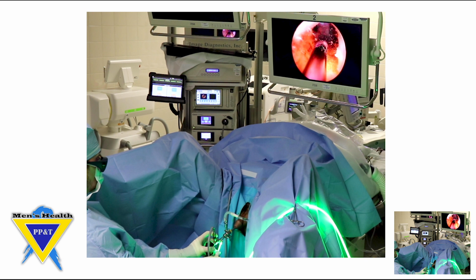As you can see in the top right-hand corner of the screen, there is a monitor which projects the picture from the cystoscope that I can view and watch while I'm performing the procedure on the inside of the bladder and prostate channel. In the bottom left and middle portion of the screen, you can see myself, the surgeon, directing the laser through the cystoscope, which I can view on the monitor in the upper right portion of the screen to follow along and direct the laser treatments.